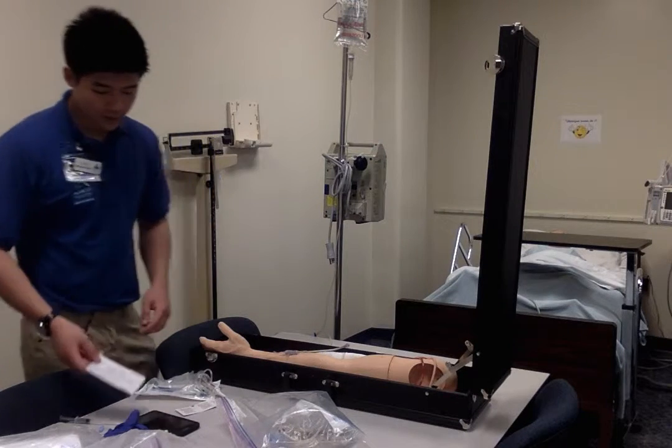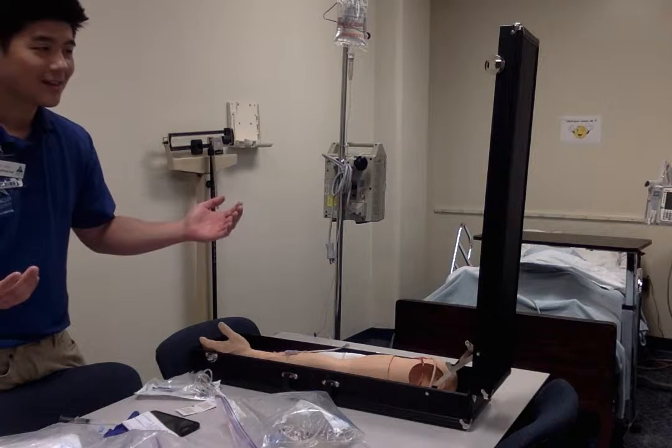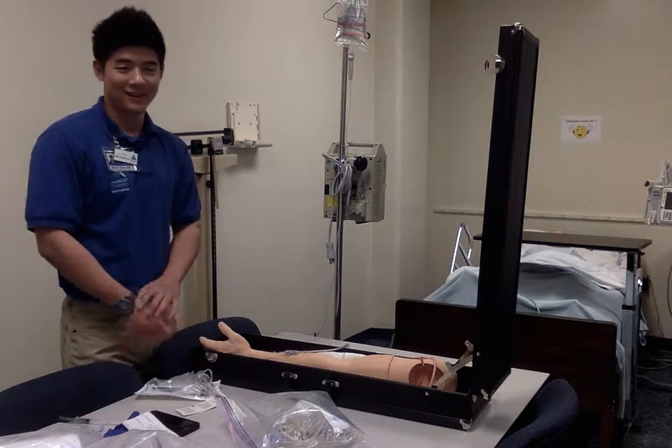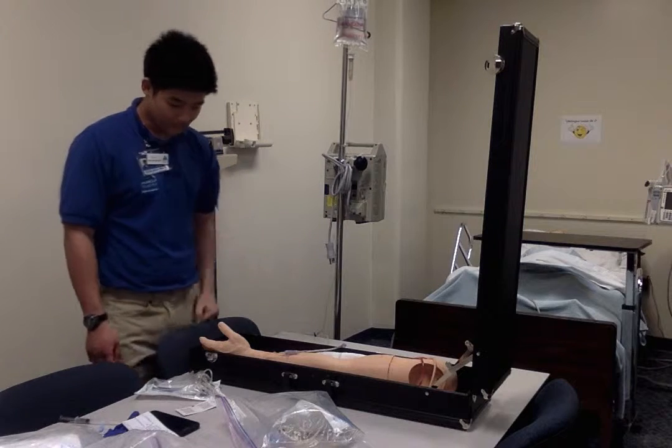Alright guys, so this is going to be my third video out of 4, which is the Piggyback. Assuming that we have a primary line with saline solution flowing.